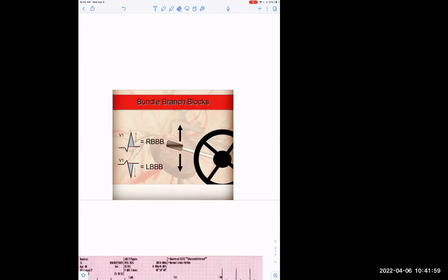Okay, awesome. All right. And I want you to keep in mind, again, I'm really doing a 10,000-foot view of bundle branch blocks, because there are more criteria. So, I gave you just the prima facie example of right bundle branch block, along with our criteria of a QRS duration greater than 120 milliseconds.